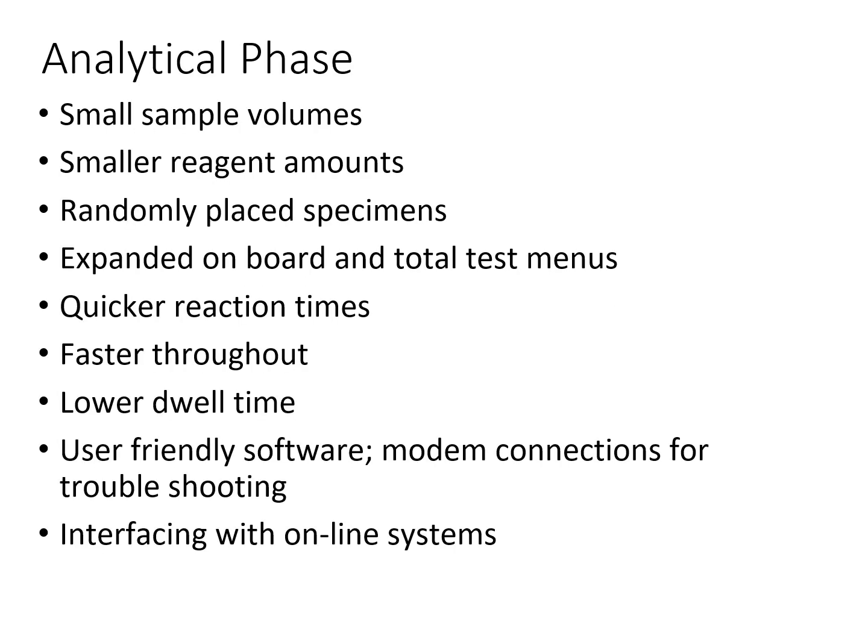Analytical phase. So you can have small sample volumes, and that requires minimal amounts of patient sample, which can preserve the specimen. Some people you just can't get a lot, and sometimes you need a lot of tests. So it's nice that we need a small volume now. Reduced reagent uses. It uses smaller amounts of reagents, which also reduces the cost and waste. Random specimen placement, so samples can be placed in any order, which also enhances flexibility and workflow efficiency.